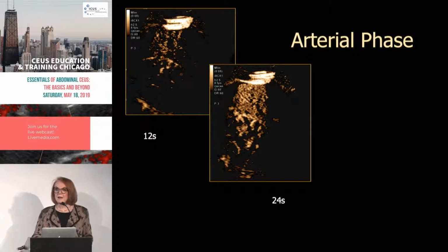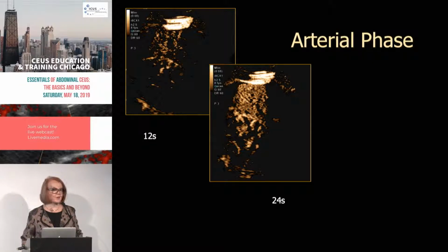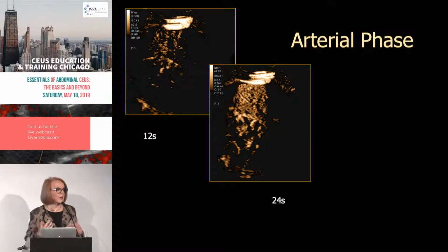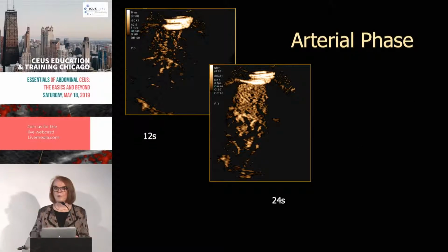So I decided that instead I had to go after those techs. And so I got first one, absolutely sensational, and then two, and then more techs. Now there are actually 5 technologists trained in my center, which is a fraction the size of the Toronto General. Originally I would get them to get everything totally ready, prepared, tell me if they wanted me to come in and scan with them, and we would look and plan things together. But as they've gotten more and more competent, the truth of the matter is that they become more competent than you.